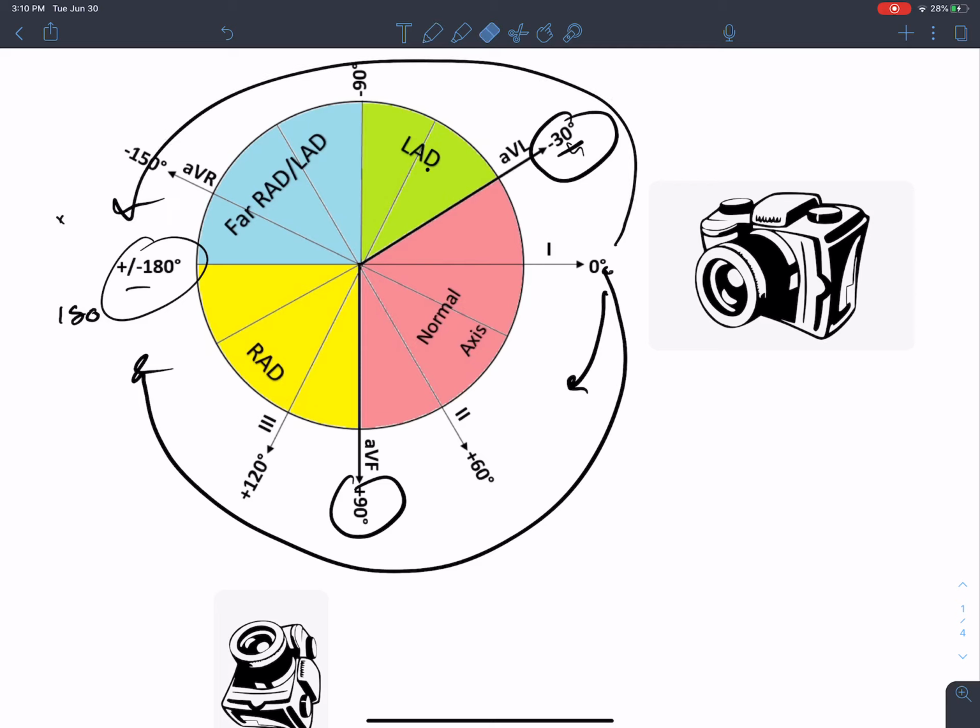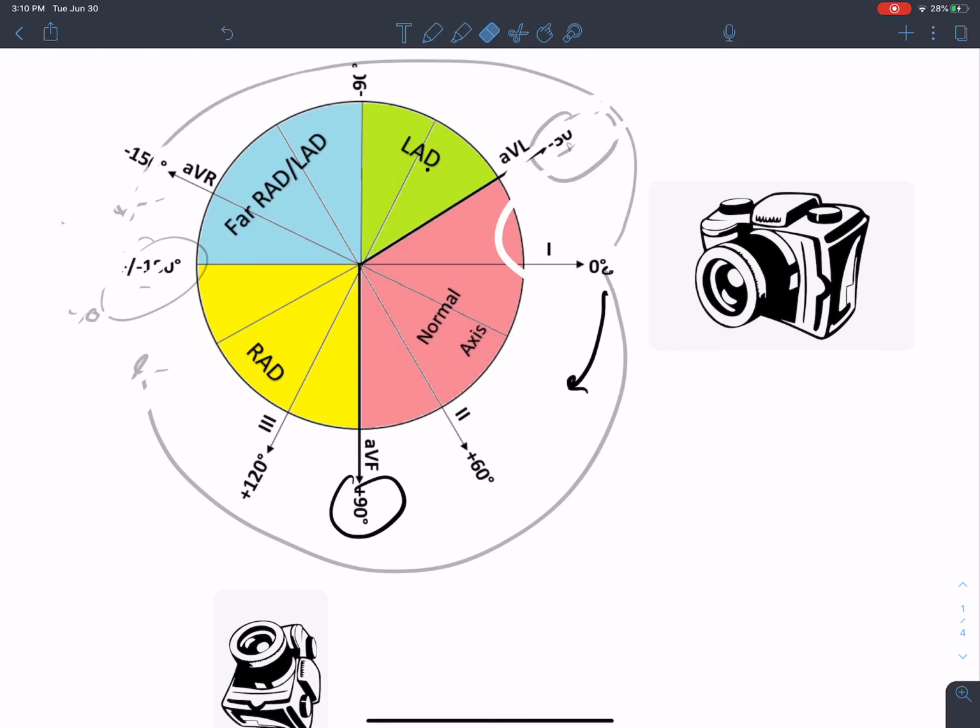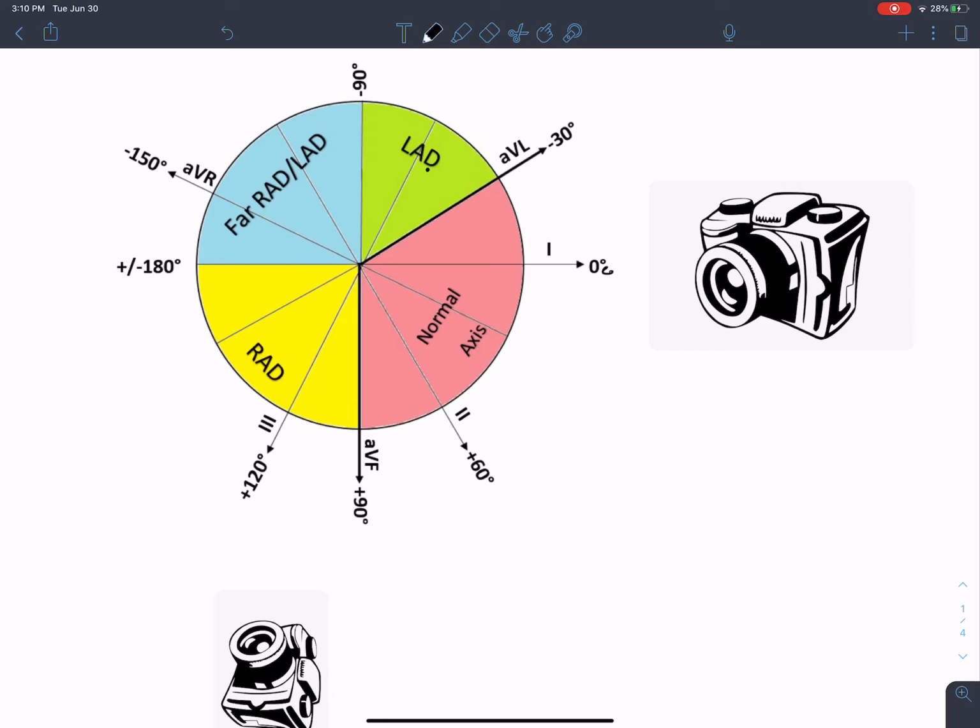I think there's some mathematical correlation there too, but I don't math, so we're going to just erase everything here, and we're going to talk about the thing I do know about, which is axis. Now, when you're looking at this, keep in mind anatomical location, and your heart is right smack dab in the middle, but your heart's red, so we're gonna color it in red.